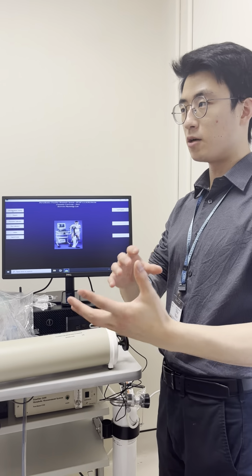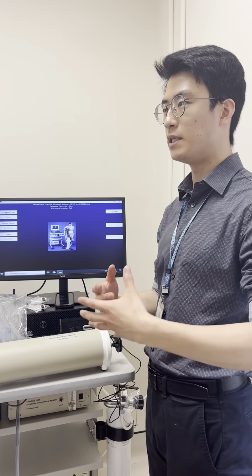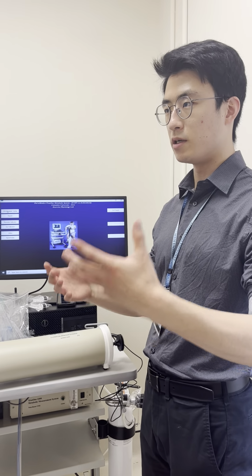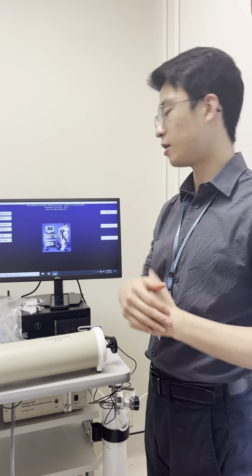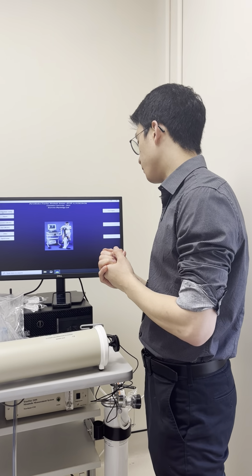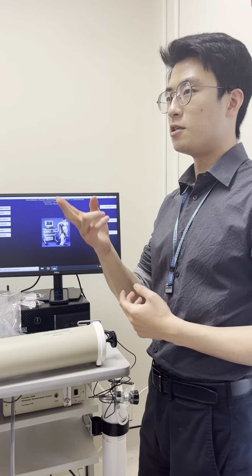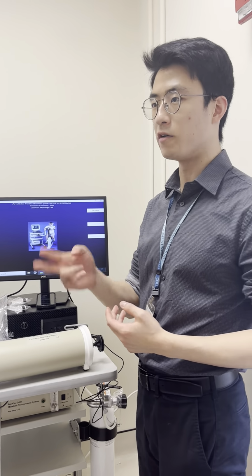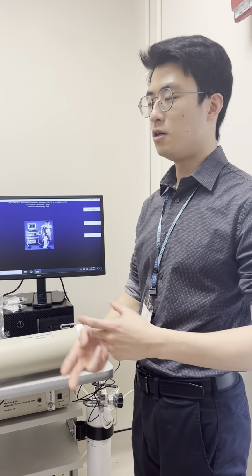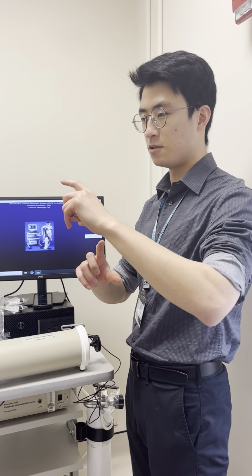And conversely, carbon dioxide: when all of those things are happening, metabolic processes generate carbon dioxide, and so we're measuring at the mouth. It's very important that we're measuring the carbon dioxide output. The second thing that's very important to understand about CPET is the respiratory exchange ratio, RER. So that is the ratio of VCO2 to VO2.